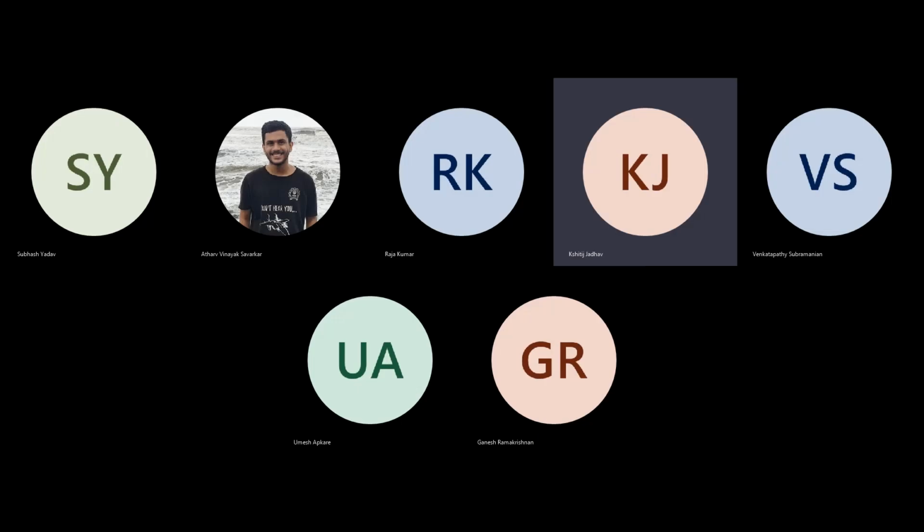applied to an open access data set, and then Venkat will show how it is applicable to the TMH histopath images as well. So I will request Raja to begin.